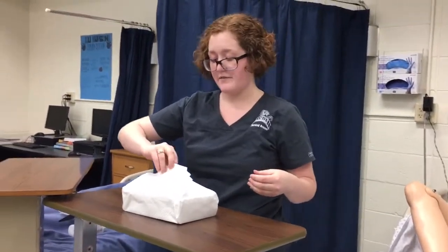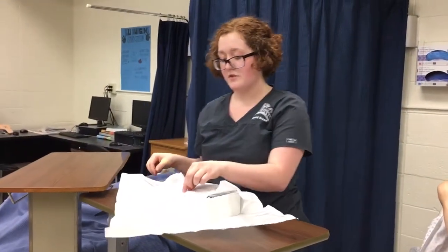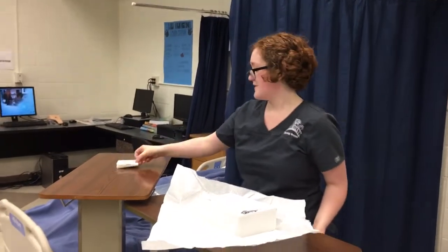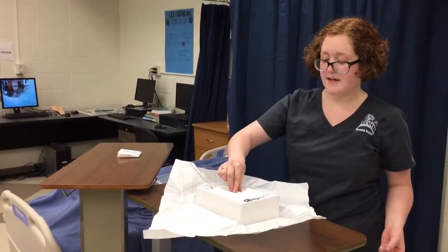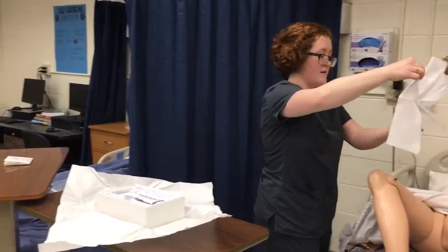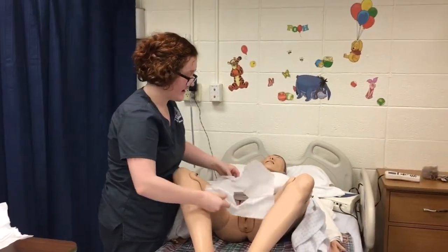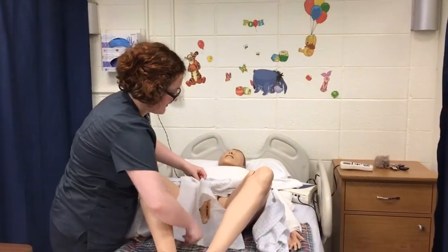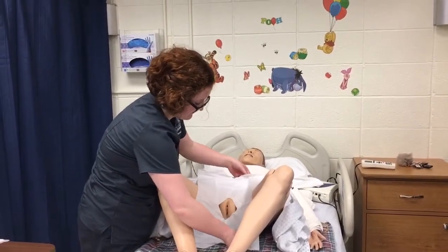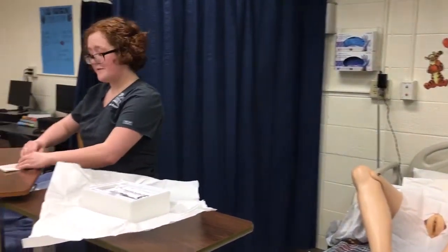I'm going to open this away from me, remembering that this is a sterile field and I don't need to cross over it. I'm going to remove my gloves and set them aside, and then I'm going to take the sterile drape, being careful to only touch the outside or one-inch border on the inside. I'm going to position the drape appropriately. Next, I'm going to don my sterile gloves.